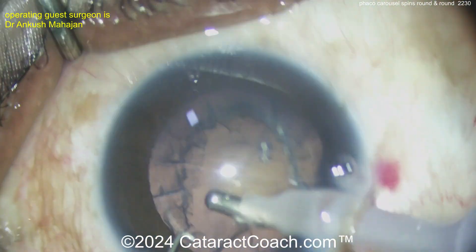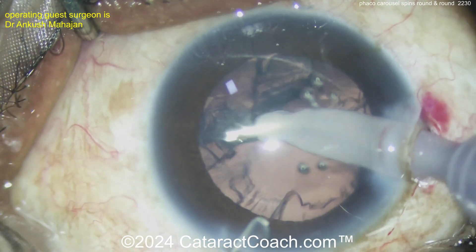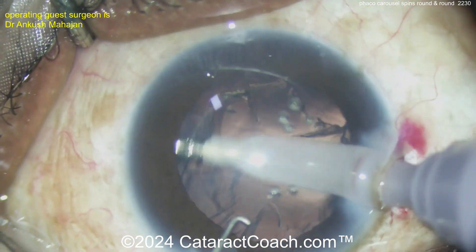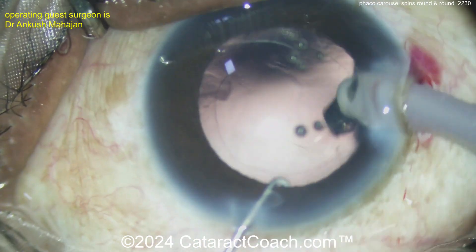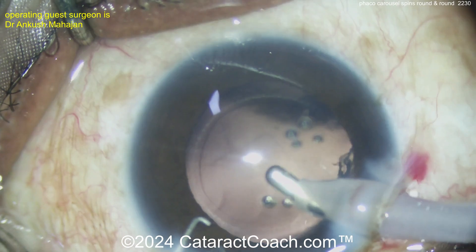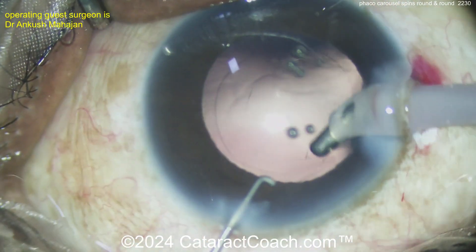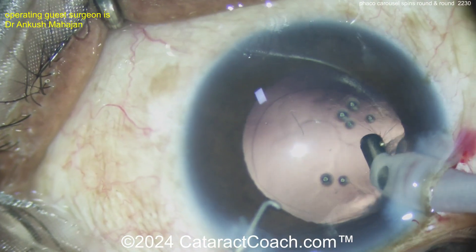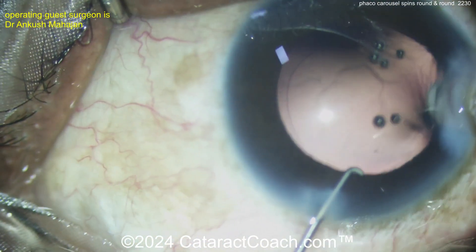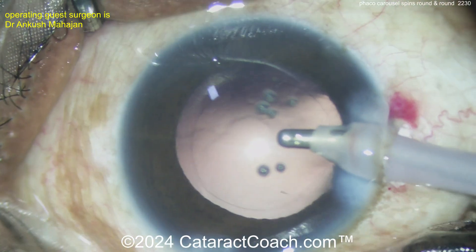We've shown similar cases of phaco carousel before. In fact, I even have a 20-year-old video on YouTube called 'Like Eating an Apple — How to Get the Nucleus to Rotate Like That.' This has obviously been published many times by many different people, but it's just a nice technique to have. A great surgeon has many different techniques in their toolbox, and therefore you can tailor it to the patient and give them what you think is the best technique.